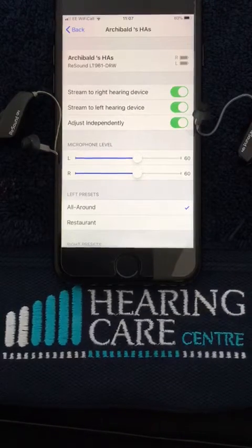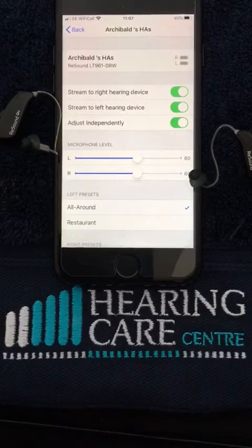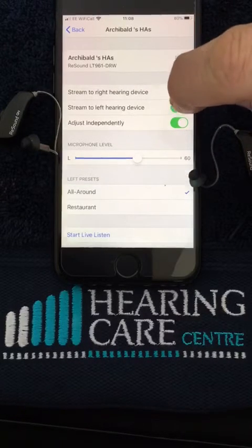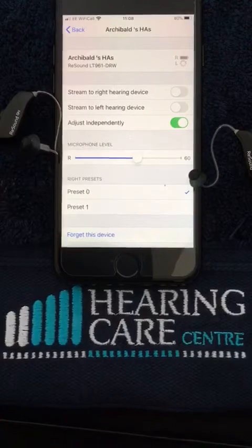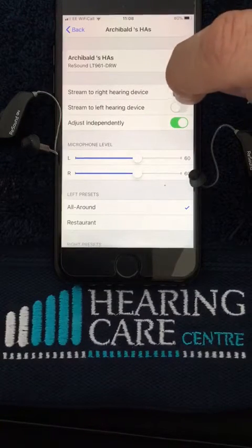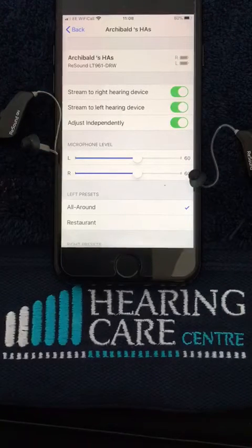If we hit on that blue tab it tells us our battery level on the right and the left, and it also tells us we are set up to stream music or telephone calls to both hearing aids. If we wish to turn that off we can simply switch the streaming to both hearing aids off, and we can then switch them back on as and when we need it.